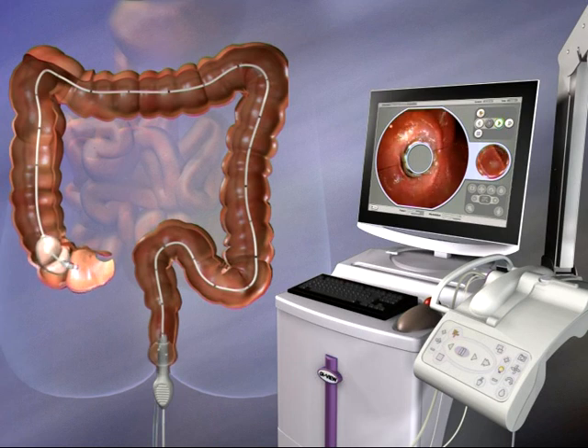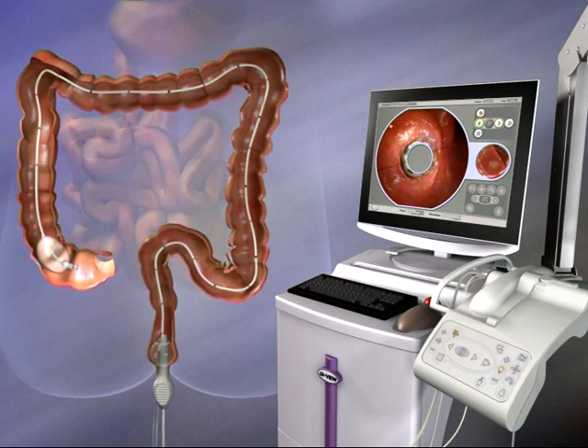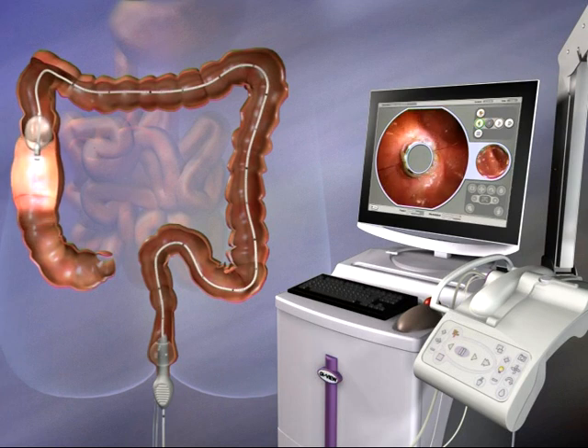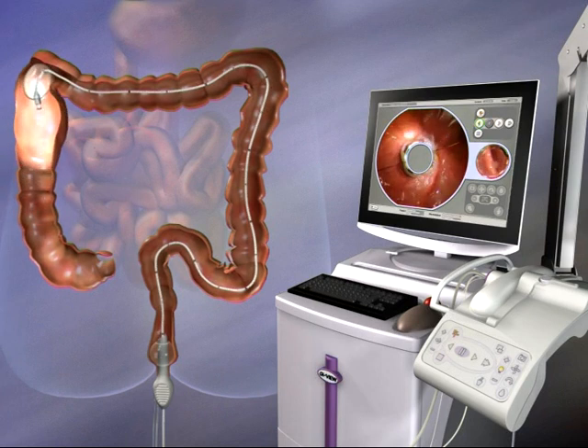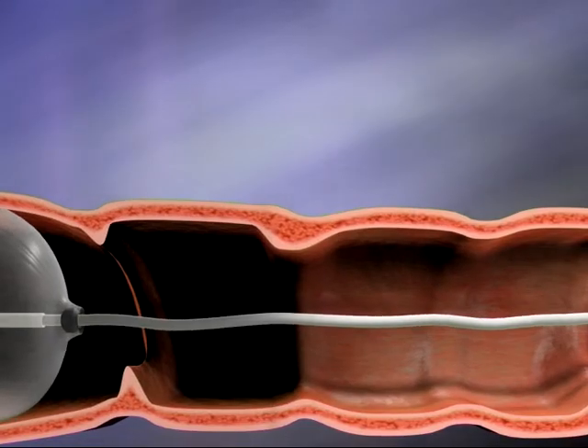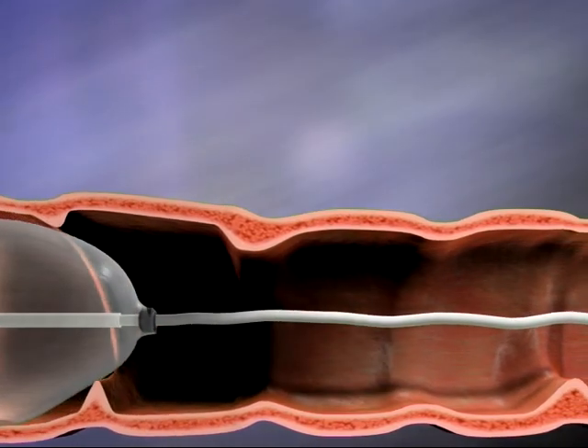When the Aeroscope scanner reaches the cecum, CO2 behind the balloon is vented through the rectum. Then the space between the cecum and the scanner balloon is inflated with CO2. The higher pressure levels in front of the balloon now force it backwards. Reverse motion may be supplemented by the operator gently retracting the supply cable.